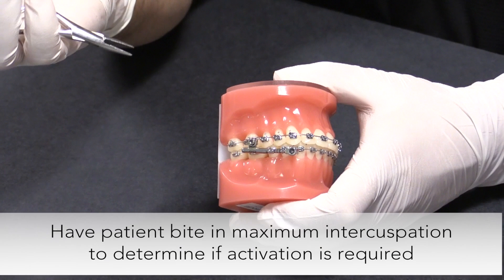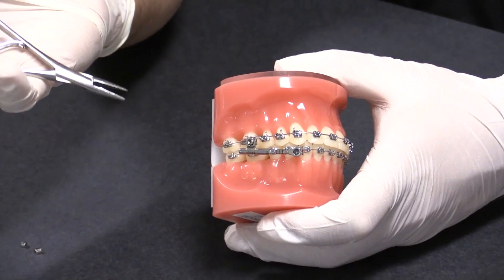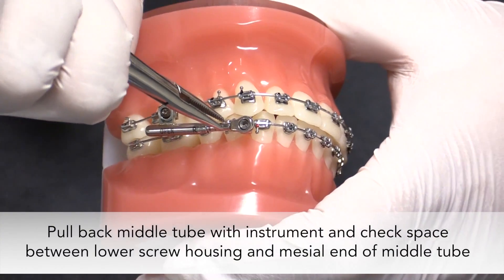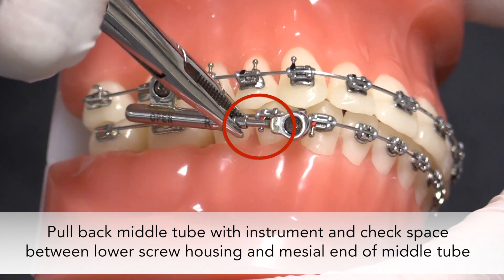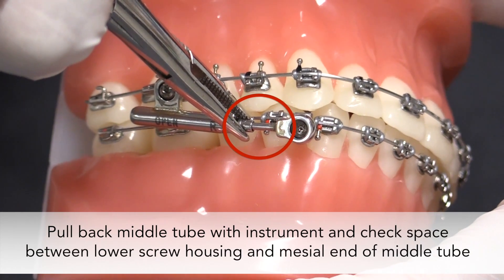First, ask the patient to bite in maximum intercuspation and reference the visual lines to determine if activation is required. Pull back the middle tube using an instrument such as a dental probe, Weingart, or Matthau to check the space between the lower screw housing and the mesial portion of the middle tube.